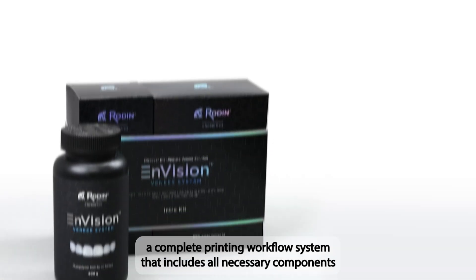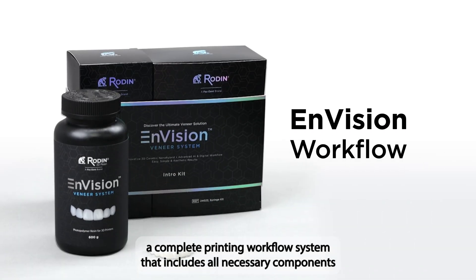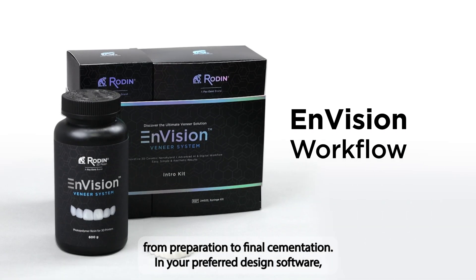Introducing Rodin Envision, a complete printing workflow system that includes all necessary components from preparation to final cementation.